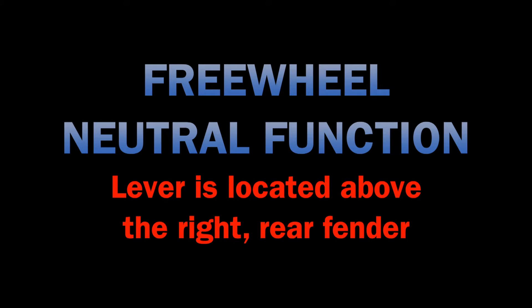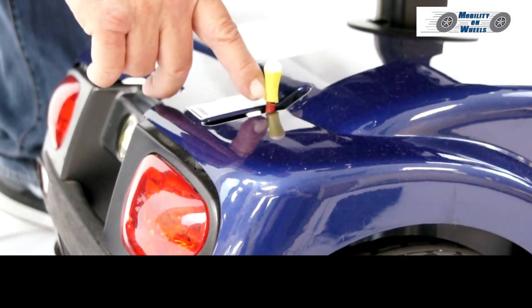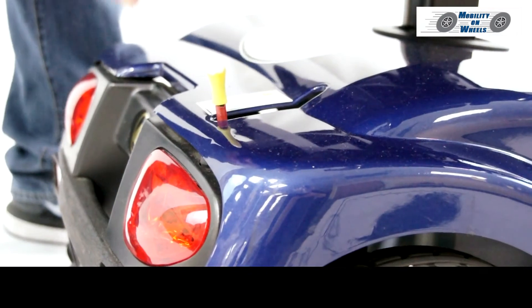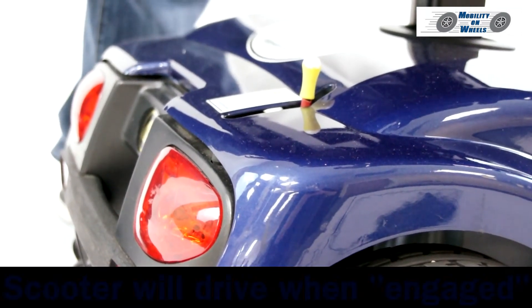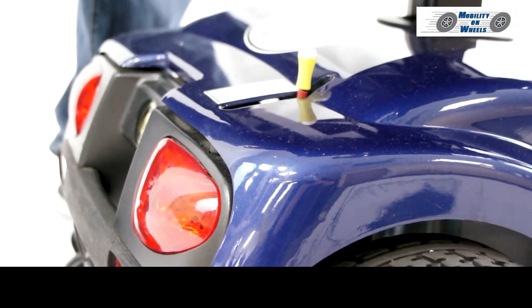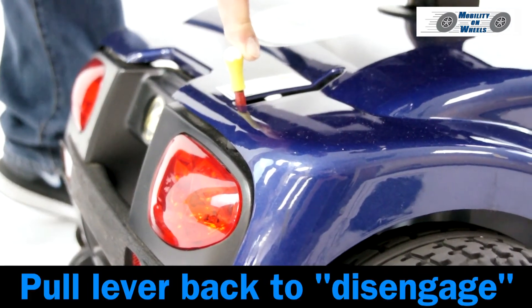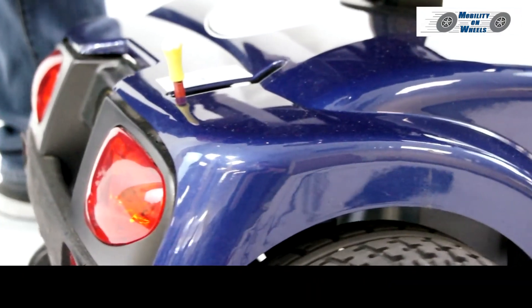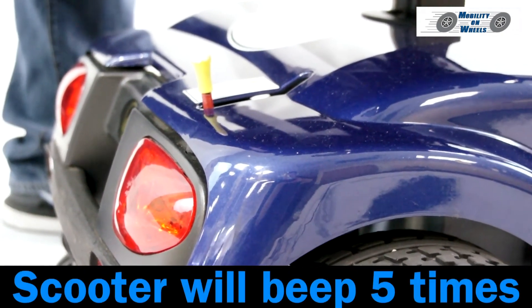Freewheel — neutral function. The lever is located above the right rear fender: the yellow gear lever. There are two settings: engage and disengage. Push the lever forward to engage. The scooter will drive in the engaged position and will beep when driving in reverse. Pull the lever back to disengage; you can then move the scooter manually. When the scooter is disengaged, it will not drive — if you turn the key on, the scooter will beep five times.